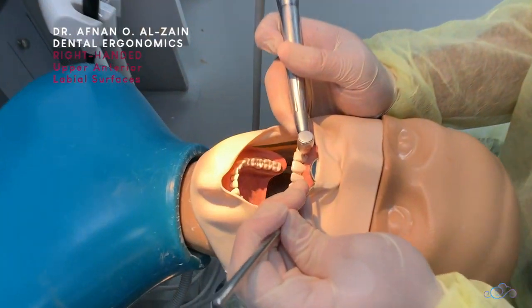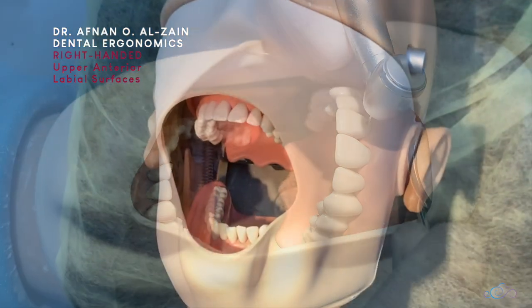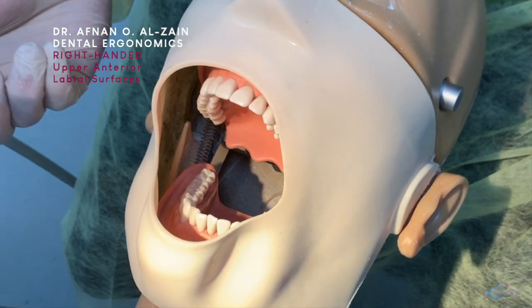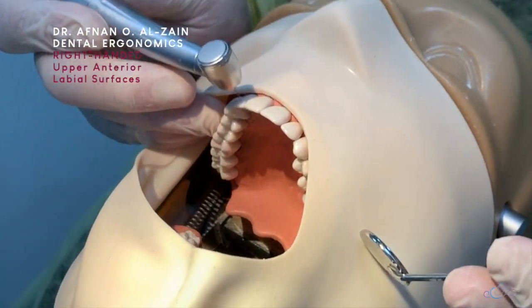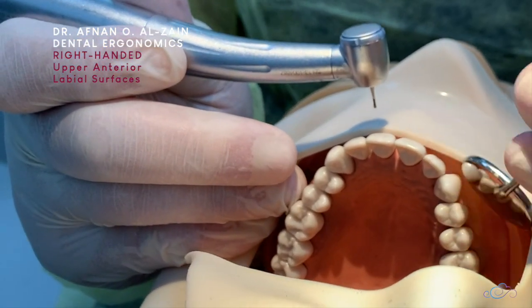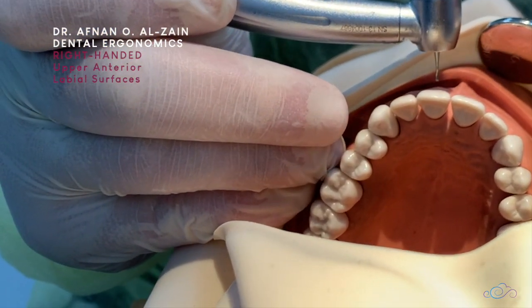When working on maxillary teeth, you're going to sit behind the dummy head. Place proper finger support on the alveolar bone or teeth, then place the burr perpendicular to the labial surfaces, cut, and retract the lip.